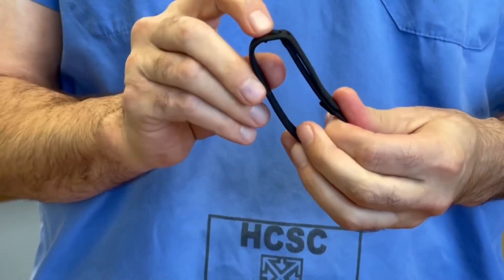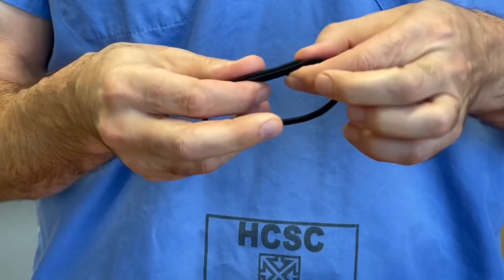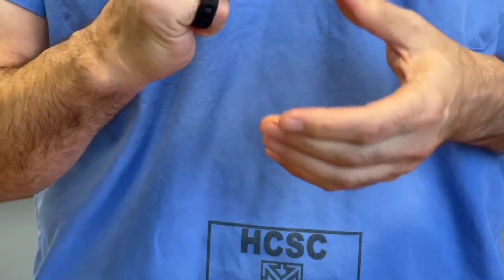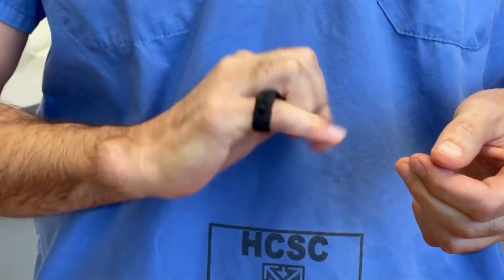So notice: belt loop configuration on the first lock, simple tab lock on the second configuration — goes back on the hand, keeping nice relative motion.